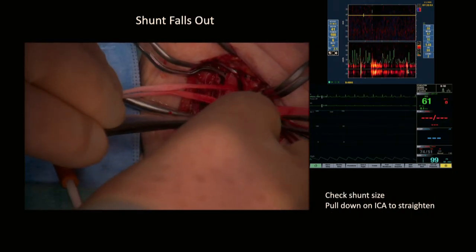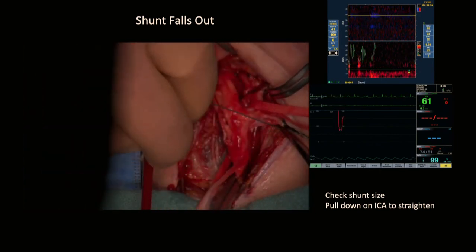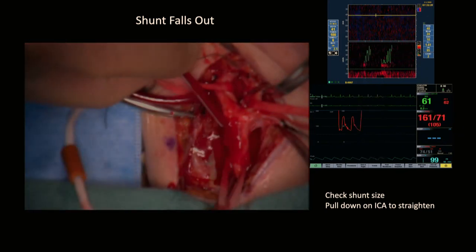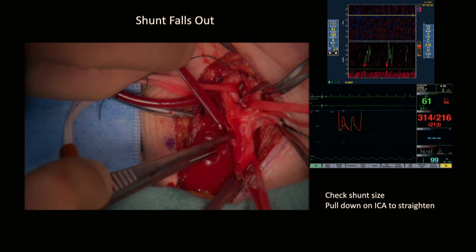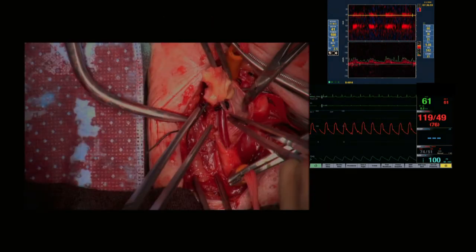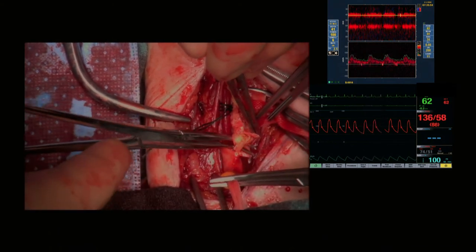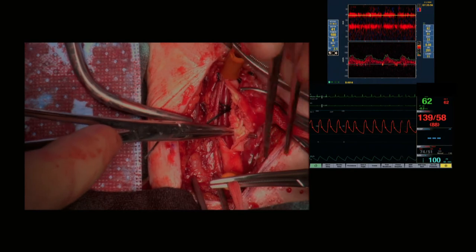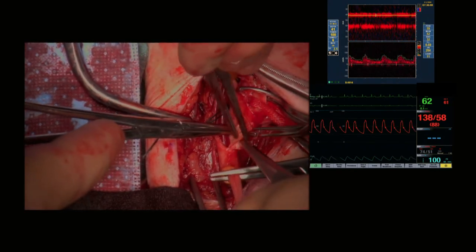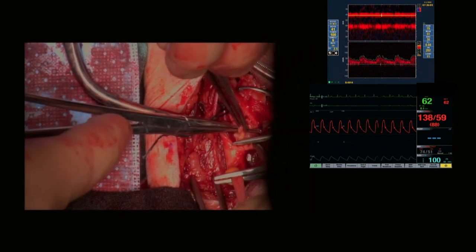And one of the beauties, if you keep your eye on the screen, see the blue right now? This is a reverse flow in the middle cerebral artery, because until now, you see everything red. Meaning that you have a blue signal from the cortex. From the cortex, you receive the flow towards the proximal MCA. And this is, I think, why I wanted to show you, to see what we saw on the ultrasound, what was that calcified plaque? So this is how you're looking at it. And this is your view.